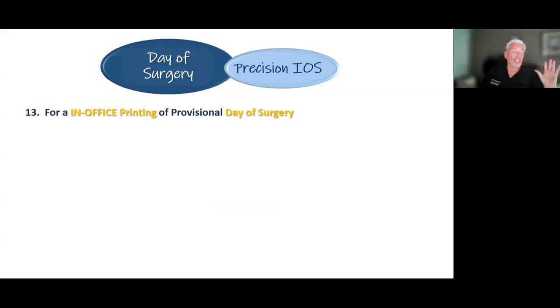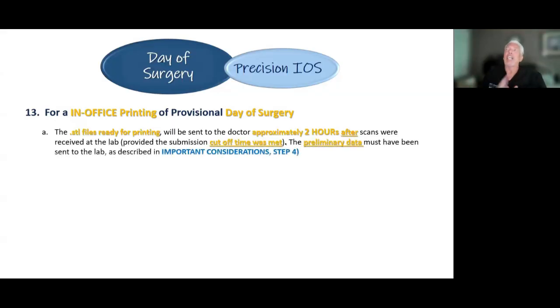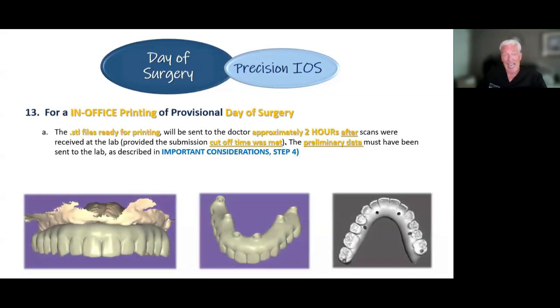So I want to focus a little bit here now on what you are getting. I keep hearing a lot of doctors say they want to do in-office printing. Talk to people that are doing it and have done it. I really encourage you to do that. There's a lot more to it than you may initially believe if you haven't had a colleague doing this. Maybe go to their office and watch what it takes. You're probably going to have an assistant do a lot of this, usually your most skilled assistant, and they're going to try to fit this into their busy day.